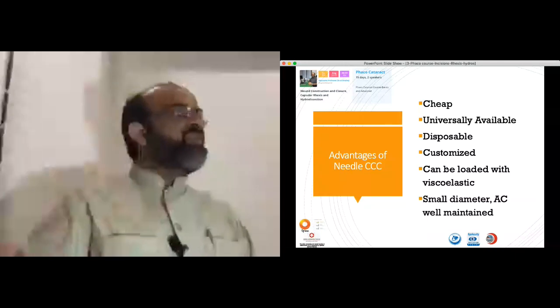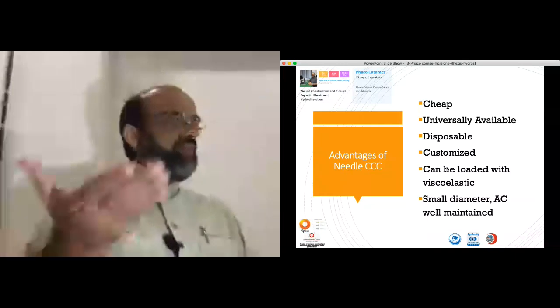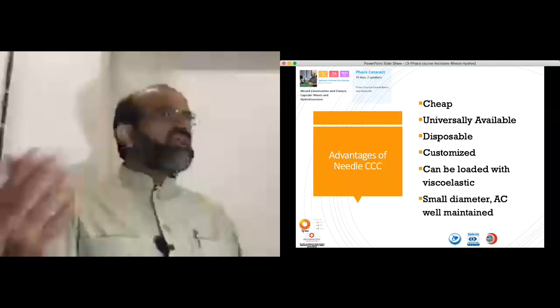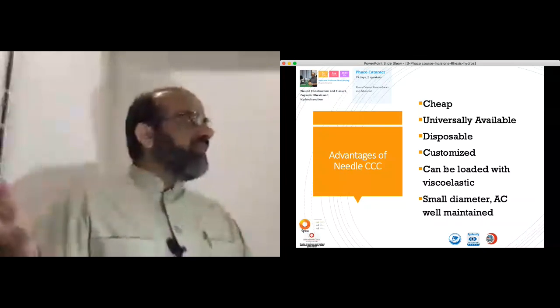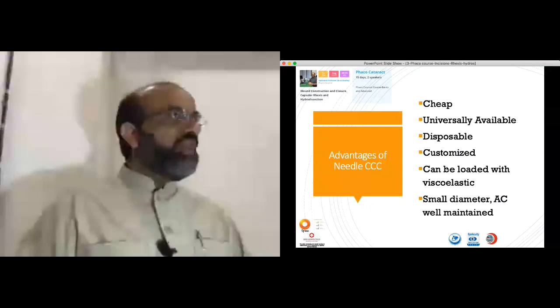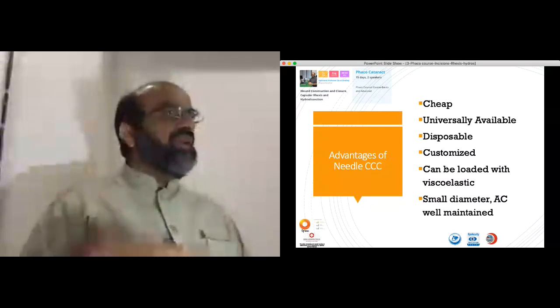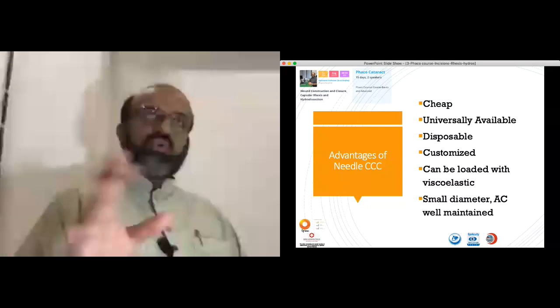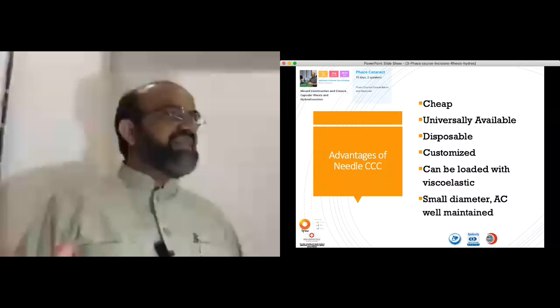For example, in hypermature cataracts you don't need any staining. So in femtorhexis you can achieve any size with great ease. So there is another machine with the name of Zeptorhexis. That is also a needle which is supplied a little energy by a machine, and you can complete similarly. You just take a round circle, and many other machines are there with this radio frequency needle. You can use all those techniques, but if you are good with needle assisted rhexis, it is matchless.